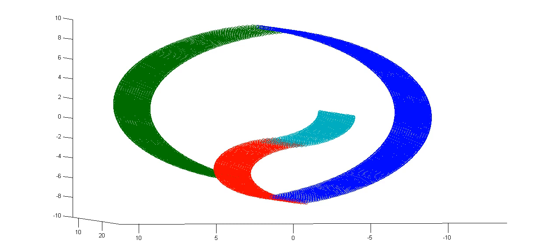And you can do this in the individual voxel way, but the hip thing is to do multi-voxel pattern analysis. That just means that instead of asking whether the activity of one voxel correlates with an input in some way, like a visual input, you look at a pattern across voxels, the activity of many different voxels in different conditions, and ask whether you can find some pattern in that. Can I say the voxels look this way during one type of visual input and another way during a different type of visual input?